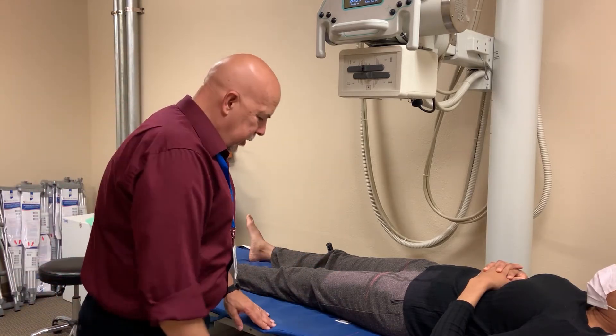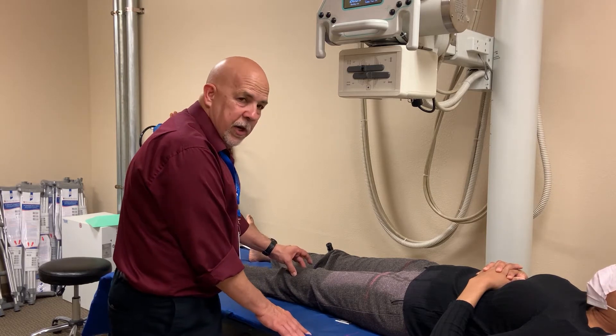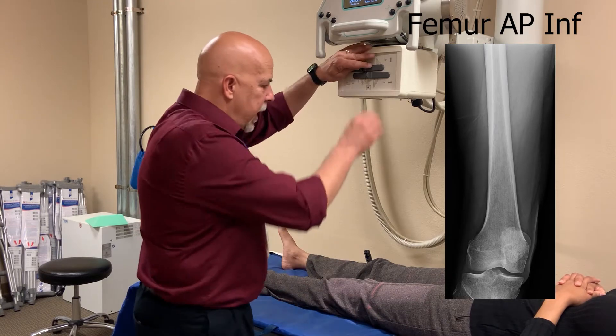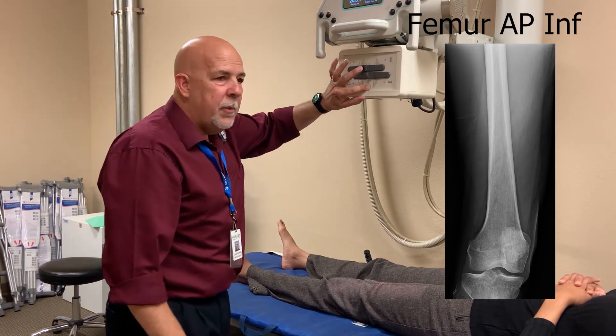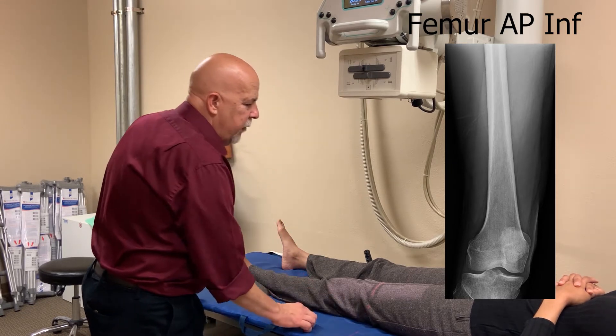After you take your first image, you want to roll down just enough so you get the entire knee. Her knee is way down here because she's tall, so you want to include the entire knee joint. You can usually collimate a little bit tighter because the knee is narrower, and you want to compensate for technique as well. So that's your AP femur.